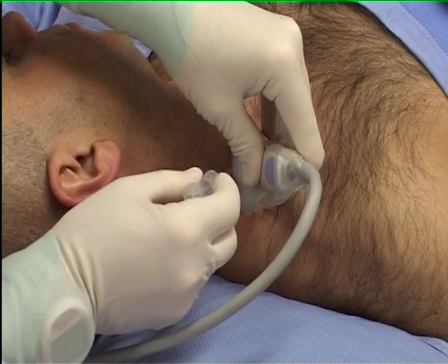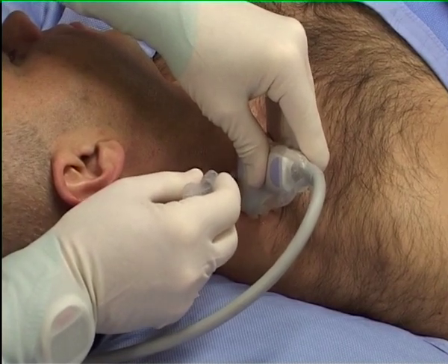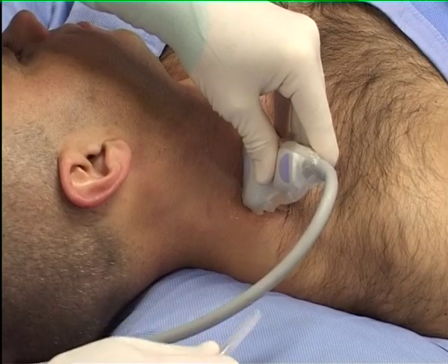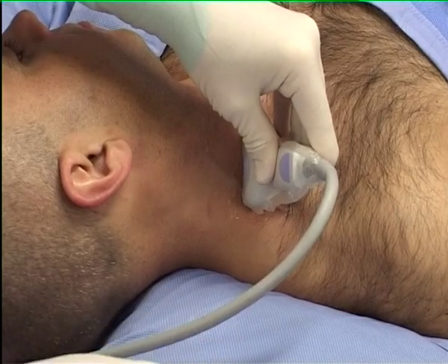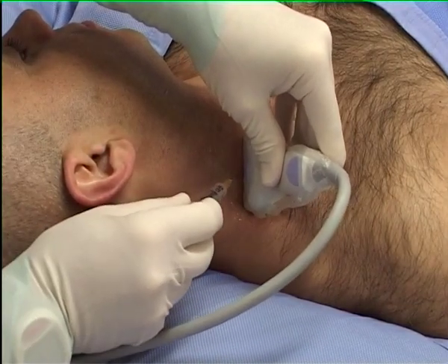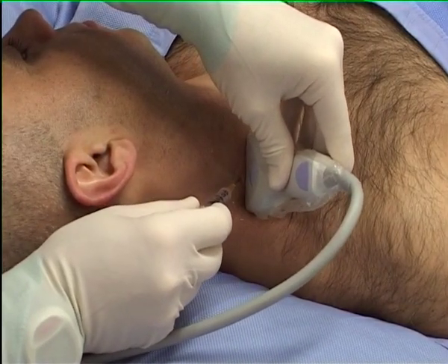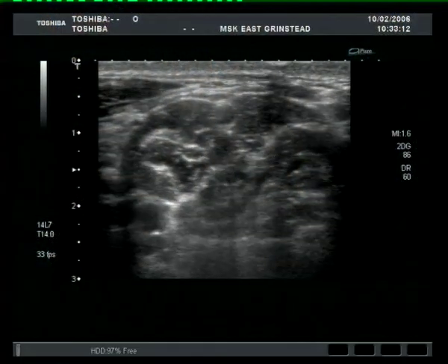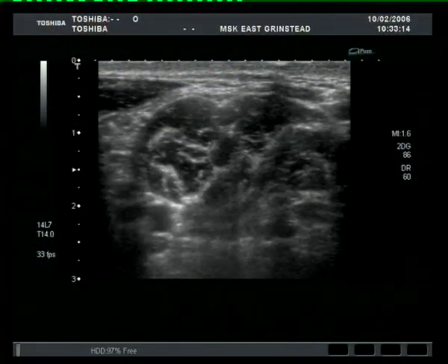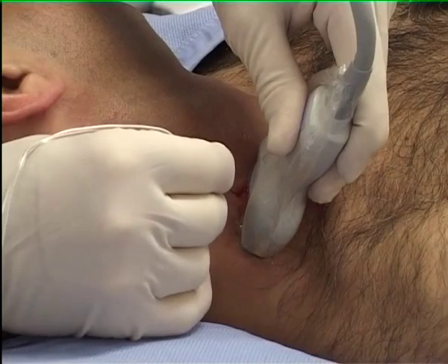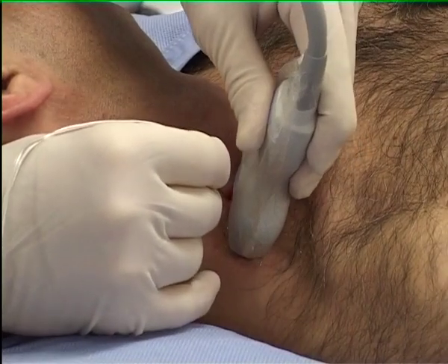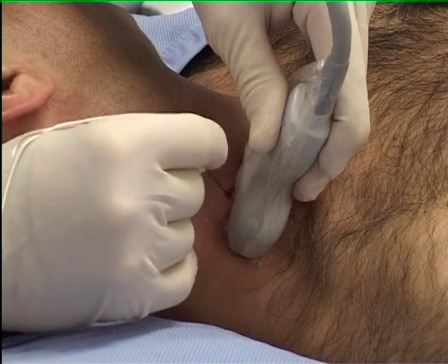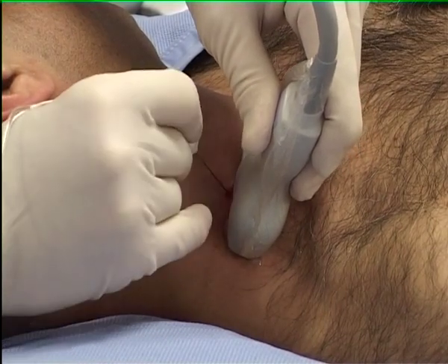Indenting the skin allows confirmation of the needle entry point. Puncture site analgesia is administered. After inserting the needle just beneath the skin, the probe angle is adjusted to allow visualization of the needle tip.